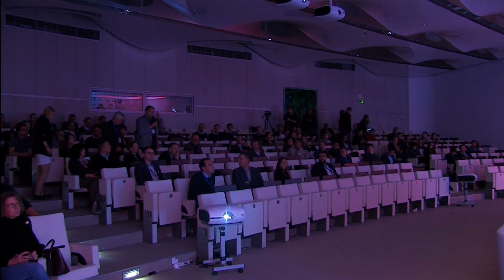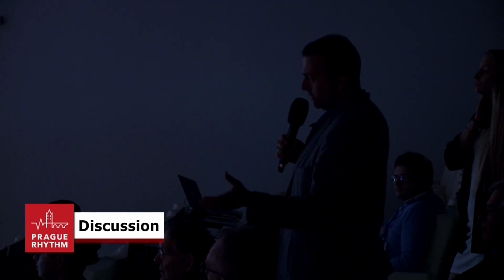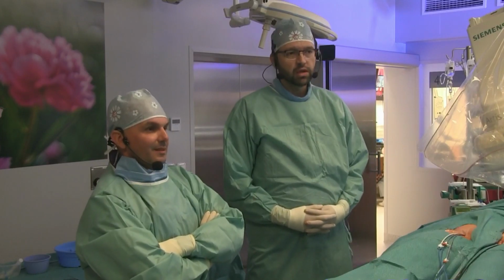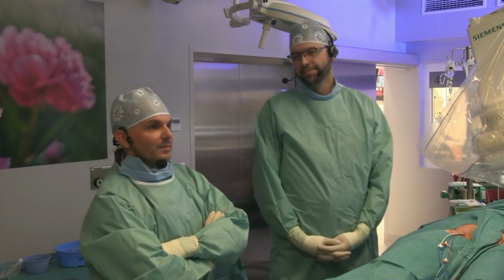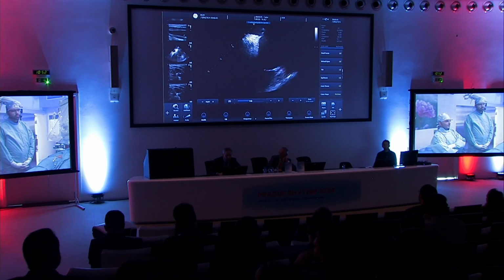So you said that you tested vagal stimulation in patients with atrial fibrillation to check whether they are denervated after PVI. Does the response to vagal stimulation differ in patients that have syncope in real life and in those patients with PVI? No, this is a physiological response. In all patients you can have a very long pause. Yes, I know, but my question is whether those patients with syncope have an exaggerated response. You can measure it in any way, or it's just like the on-off phenomenon? There is no such study I'm aware of.